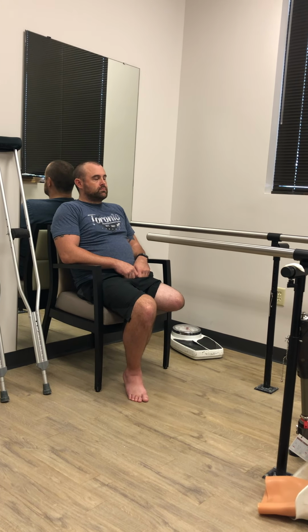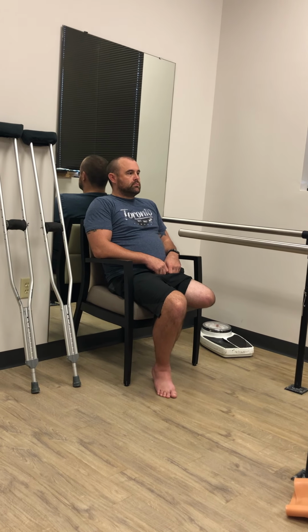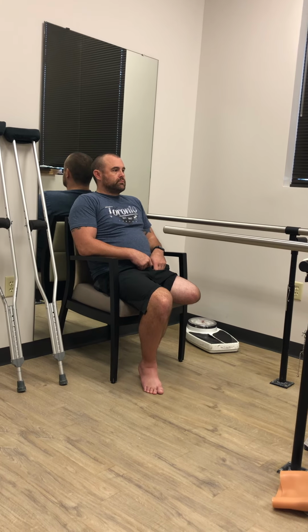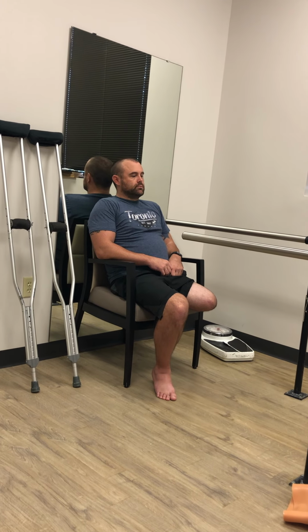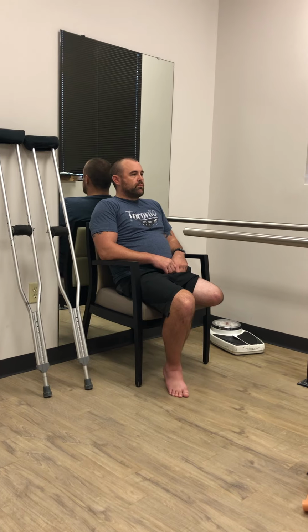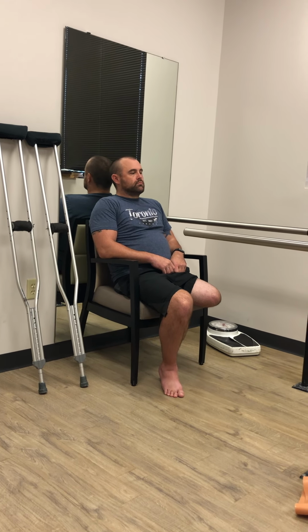But you're ready to hit the work again, and you might need to wear that boot. We probably want to align you well. As I say, we'll align you to the higher heel, and then the problem is you'll be in hyperextension in your tennis shoe. What I usually do is cut you a quarter inch crepe heel wedge and glue it in your shoe. Then you can change from the boot to the tennis shoe anytime you want.